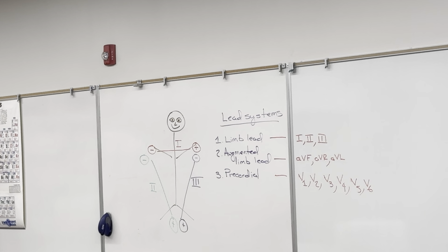Tonight, you're going to record an EKG from a member in your lab group, and you're going to be recording some of these measurements. So if you take a look at the EKG down at the bottom, you should see normal ranges for PR interval. Does everybody see that?